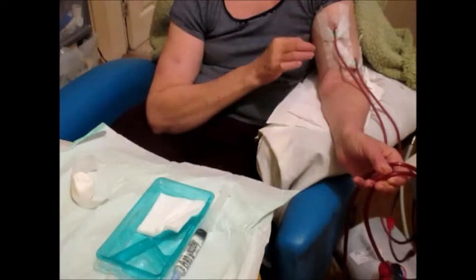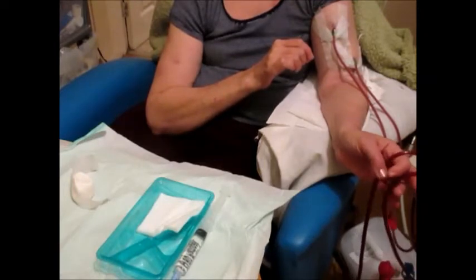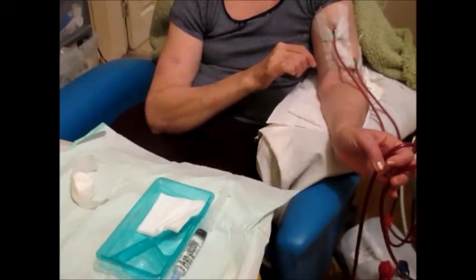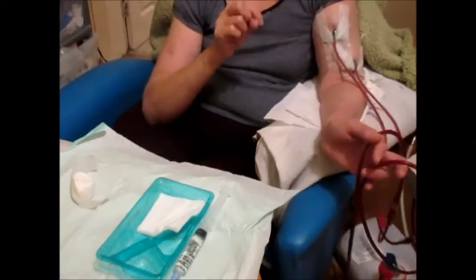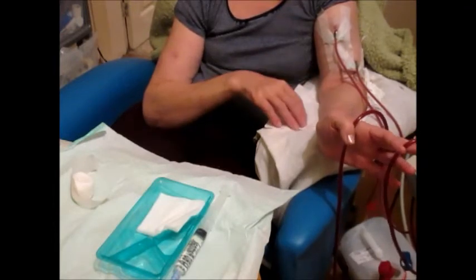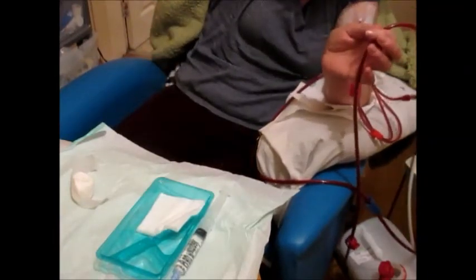Any minute now the machine is going to ping, which notifies the end of treatment. You should always ensure that you do finish your treatments — that's important to get adequate clearance of the toxins from your body and help prevent problems in between treatments. There's the ping of the machine, and I'm just going to press start to begin the reinfusion.